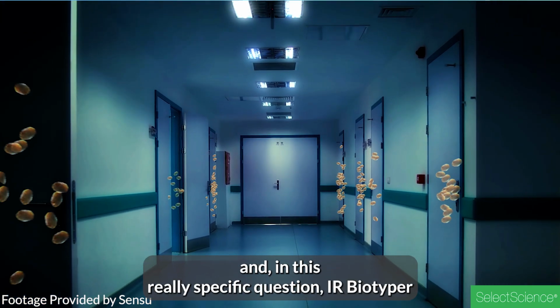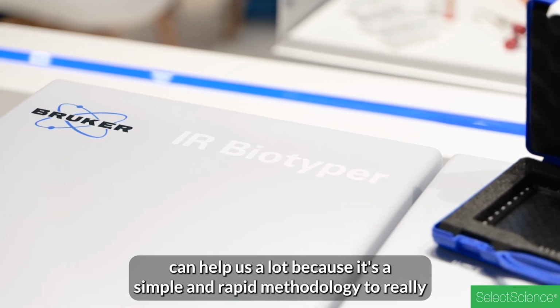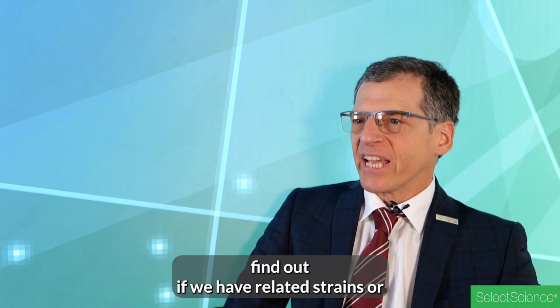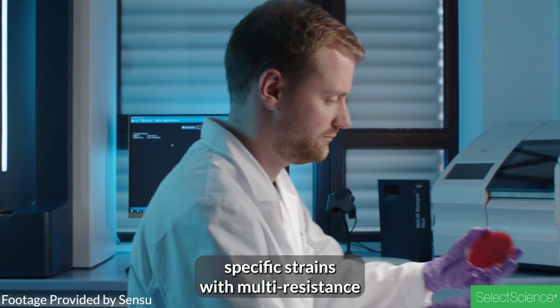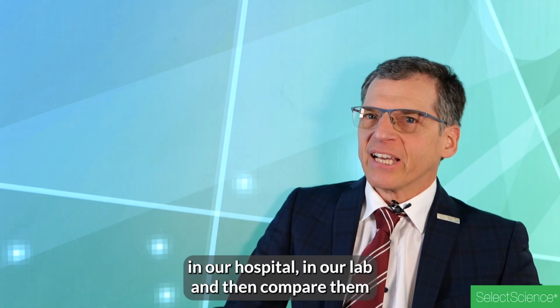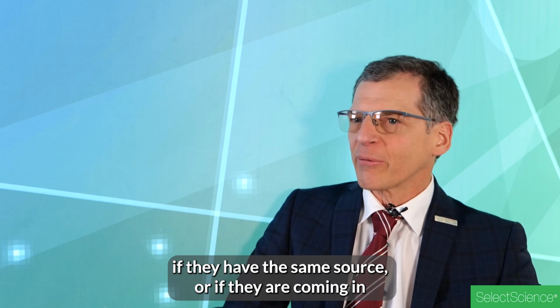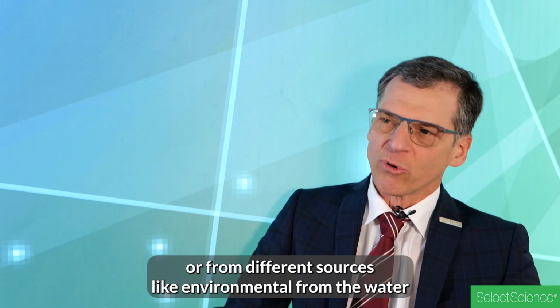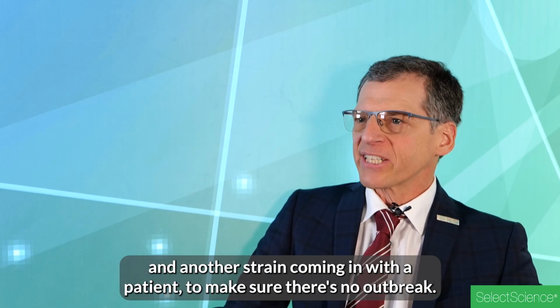And in this really specific question, IR Biotyper can help us a lot because it's a simple and rapid methodology to really find out if we have related strains or specific strains with multi-resistance in our hospital, in our lab, and then compare them if they have the same source or if they are coming in with different patients or from different sources, like an environmental strain from the water and another strain coming in with a patient, to make sure there is no outbreak.